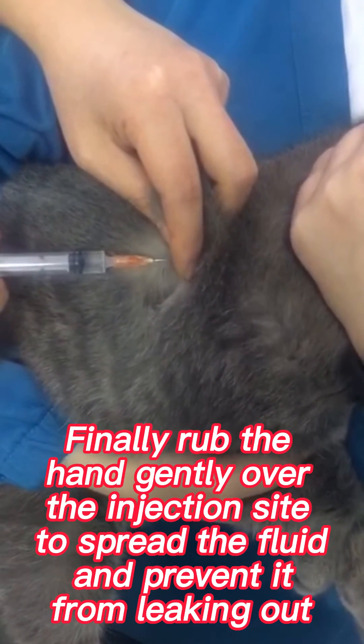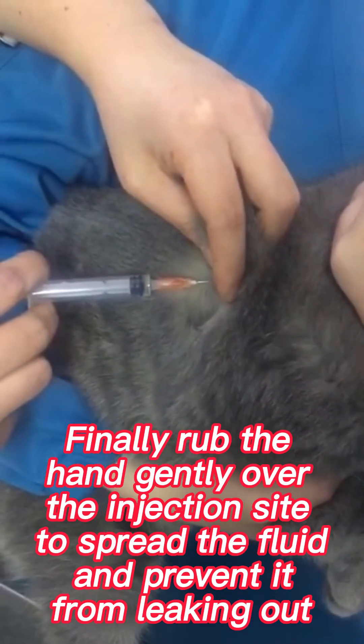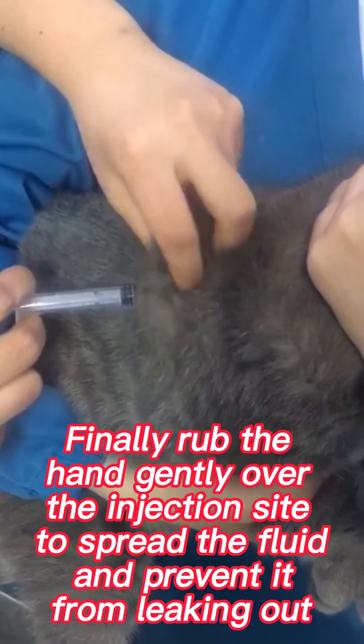Finally, rub the hand gently over the injection site to spread the fluid and prevent it from leaking out.